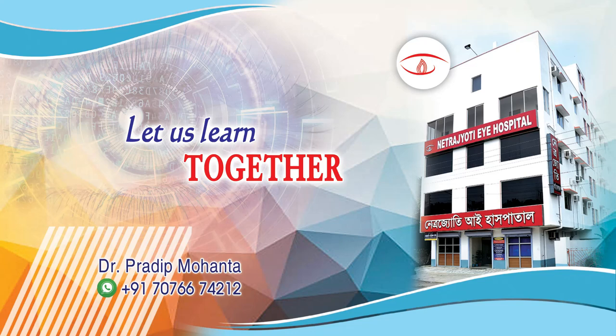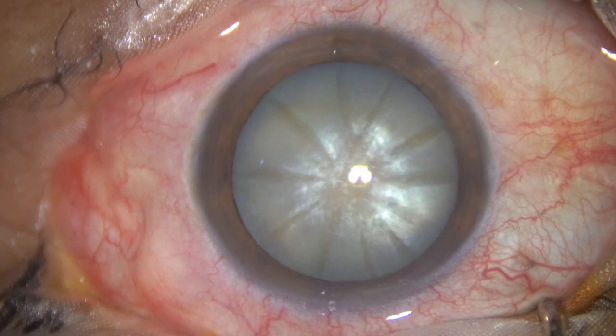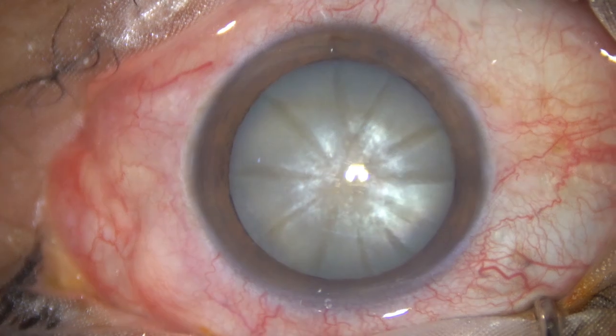Friends, welcome to my workplace at Ranagh Heart, West Bengal, India. This is an intumescent cataract. Let us observe this real-time surgery.